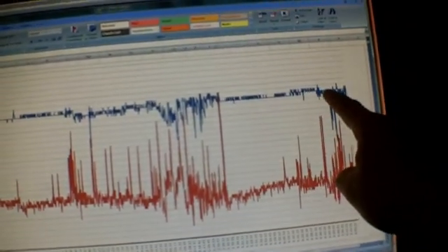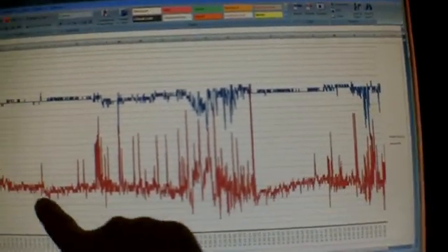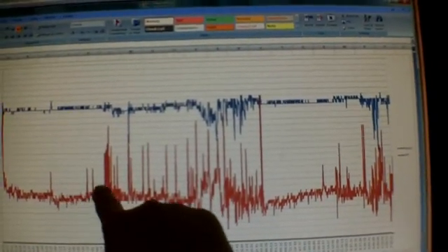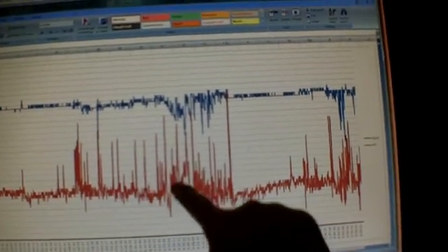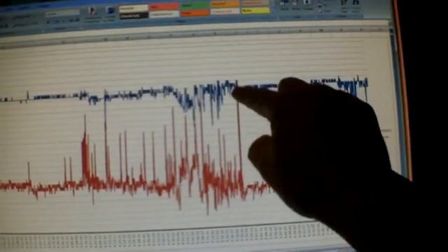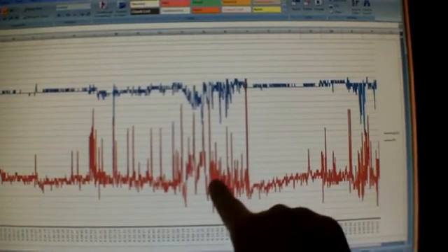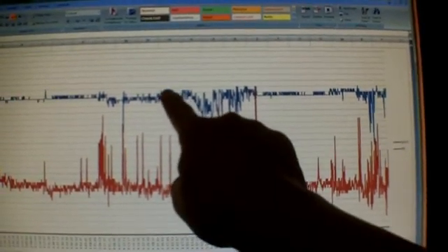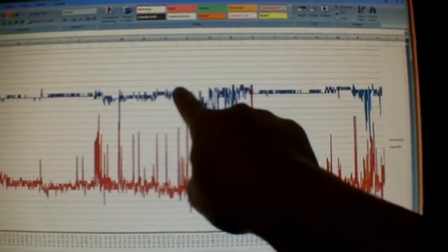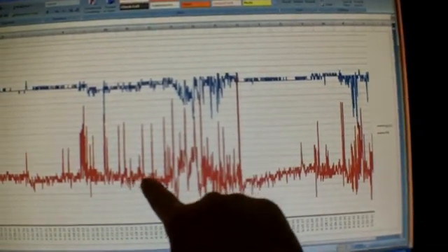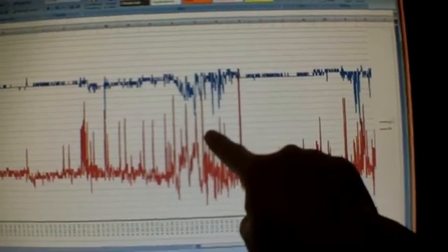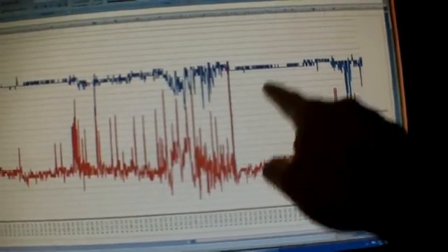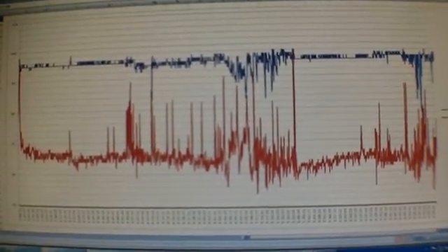Really big drops. And in my pulse rate there's really big spikes corresponding mostly to the time where my oxygen level goes down. This tells me that I am not breathing, I'm suffocating, and then my heart rate increases and I probably start choking and gasping and then I wake up, not sleeping and not getting oxygen. That's not good.